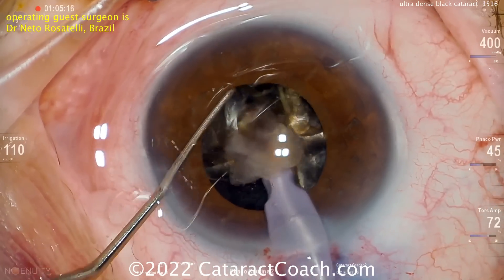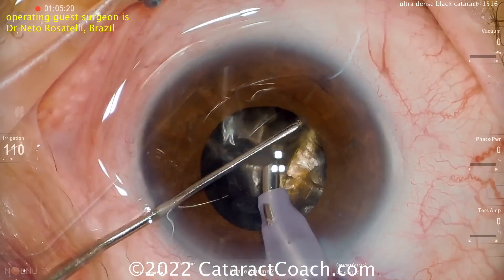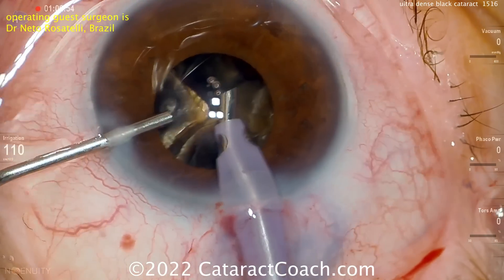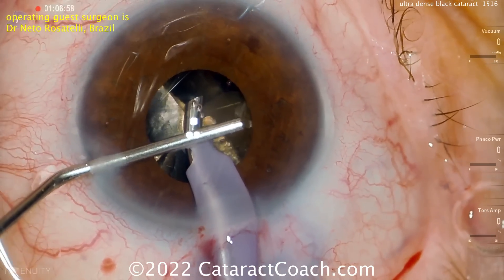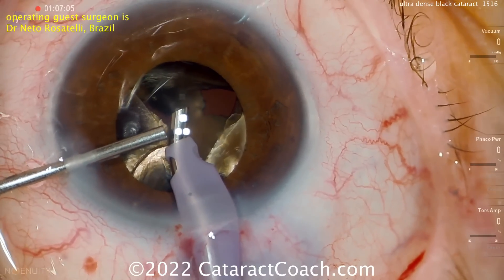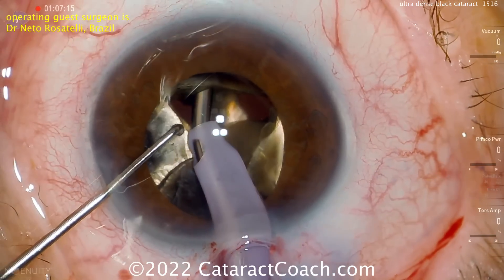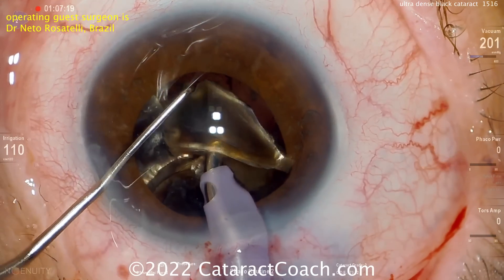Recoating the endothelium is important, as is being careful to float the phaco needle in the incision. Look at the position of the phaco needle — the metal needle within the silicone sleeve — notice how it floats there in the middle very nicely. More viscoelastic going inside the eye, inflating the capsular bag, giving you some room to work and recoating the endothelium. As you actively remove the cataract pieces, bring them forward.